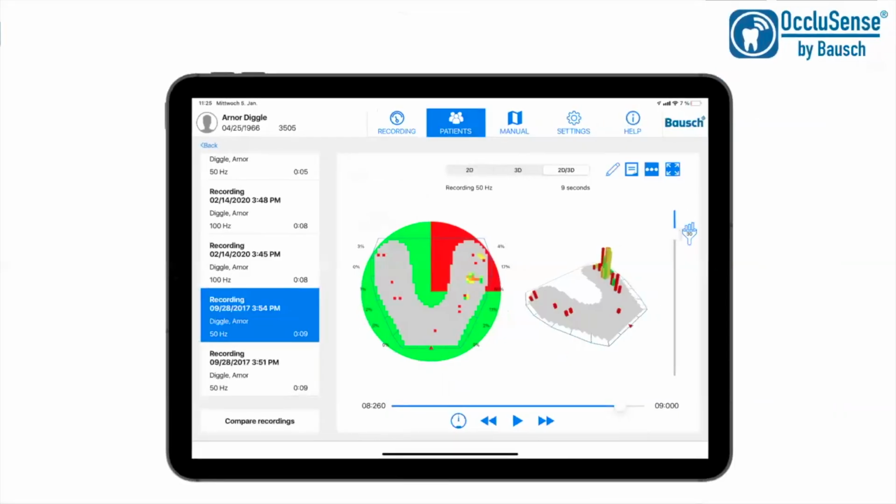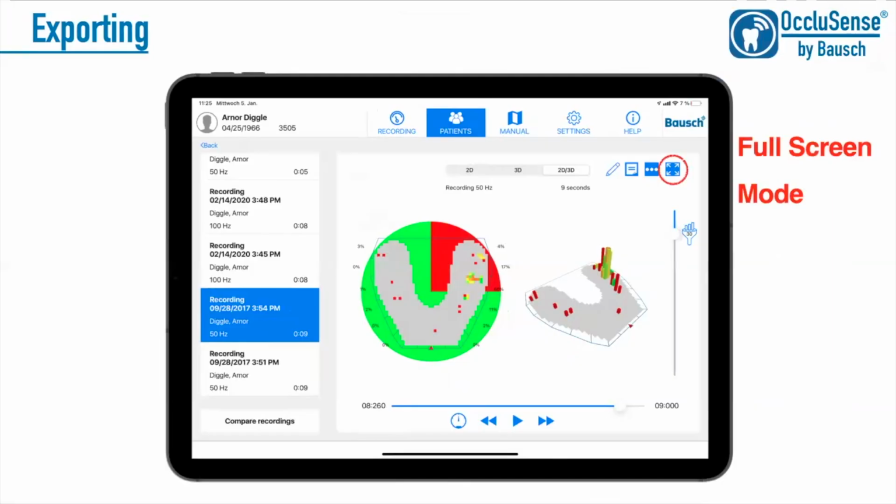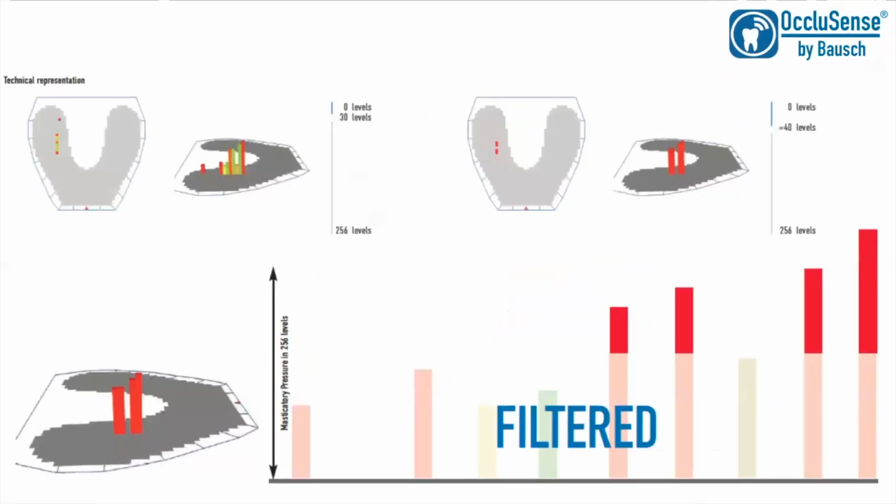This was just an annotation of the noise cancelling. Let me go back to it, because my finger was a bit faster. One moment. Here we go. So this is the noise cancelling in a simplified form. If you are looking to change the amount of pressure levels that you want to see in your recording, then this is what you are filtering.